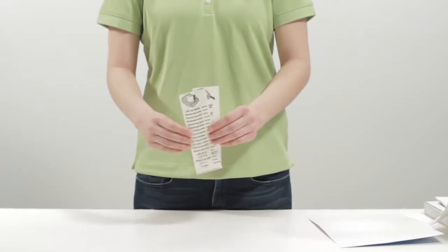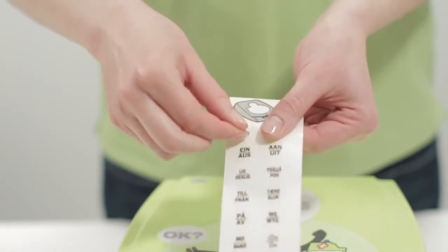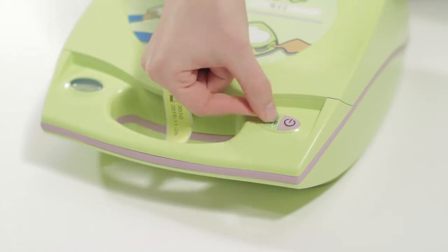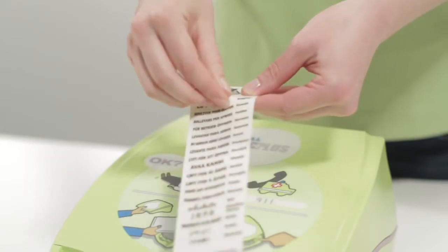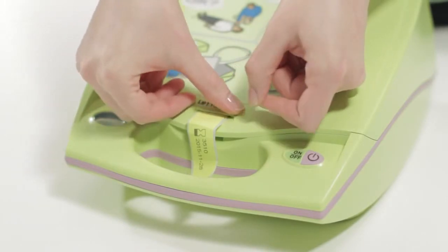Along with documentation, you'll also find 2 small sheets of labels. One contains labels for your on-off button in multiple languages. Peel off the label that says on-off in your language and affix it to the blank surface next to the on-off button. Next, peel off the Lift to Open label from the second backing sheet and affix it carefully to the space just above the slit on the lid.